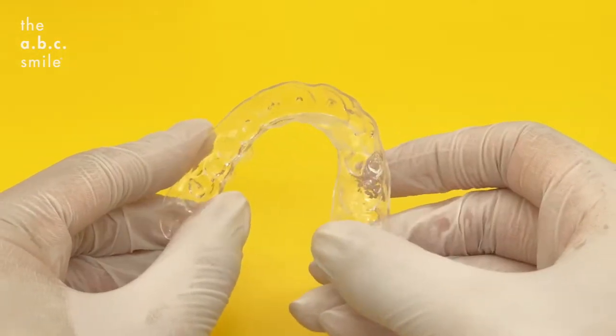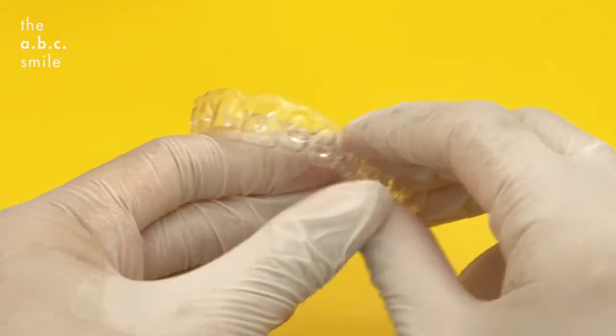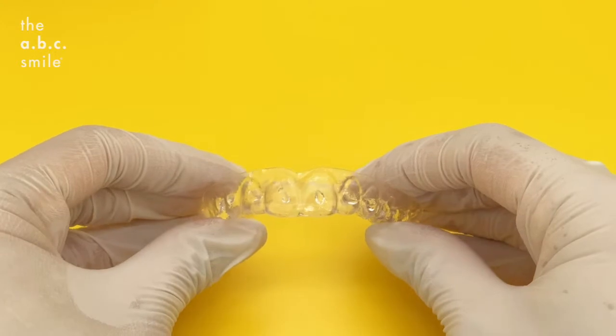Once you finish loading the gels, you can line it up with your teeth and place the tray in. In the mirror, you'll see the dot of gel spread uniformly around each tooth.